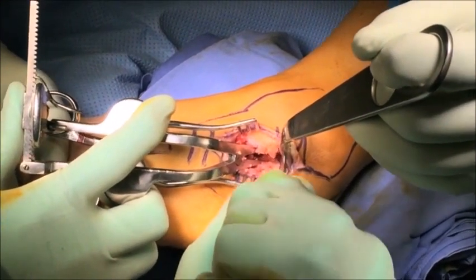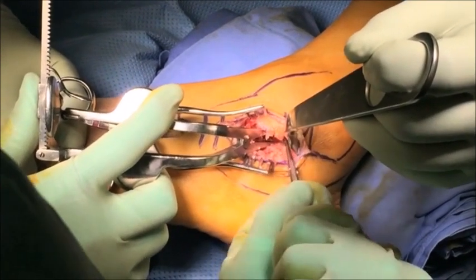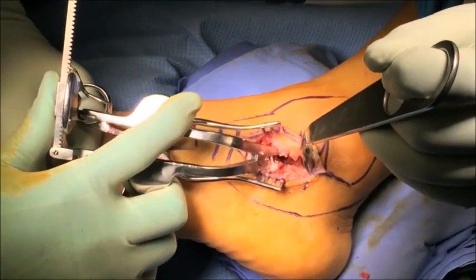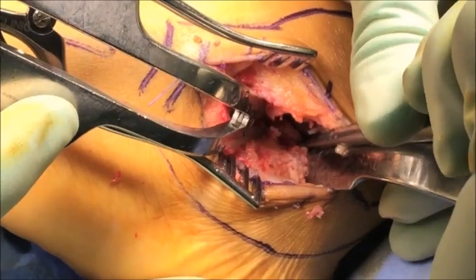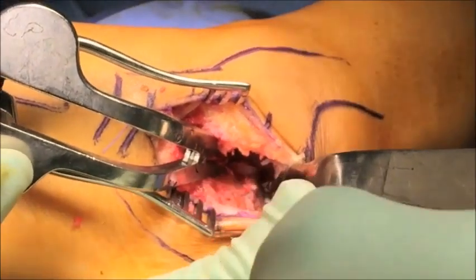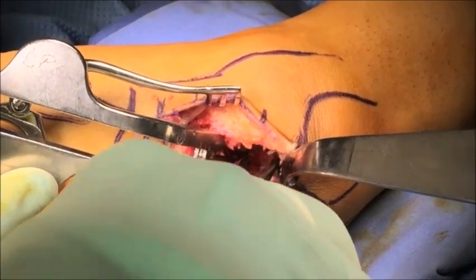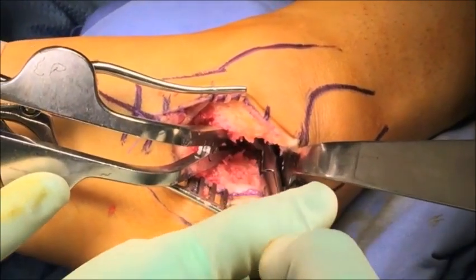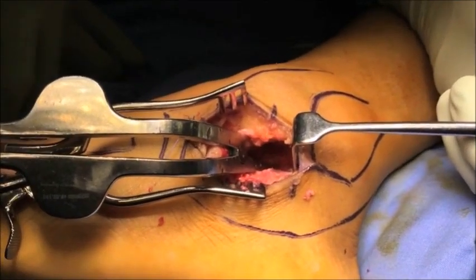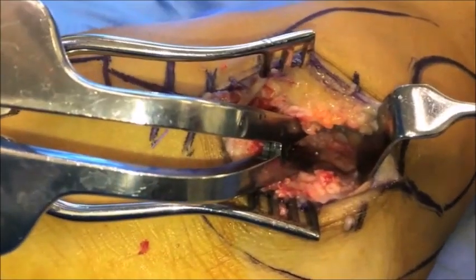Make sure to clean right across to the medial edge of the posterior facet. Be cautious when working in the posterior medial aspect of the joint as the FHL tendon runs in this area — with a sharp osteotome it's very easy to damage the tendon. To confirm that you have cleaned to the medial edge of the joint, there is often a small posteromedial fragment which is visualized here. This fragment needs to be removed. Once it's removed, the FHL tendon will become visible in the depths, confirming that you've cleaned the full extent of the joint.